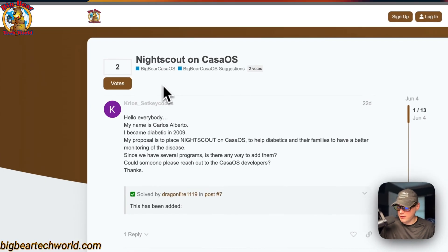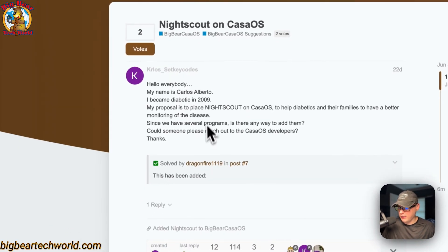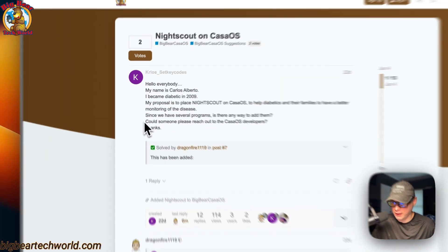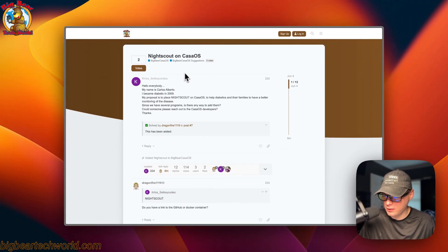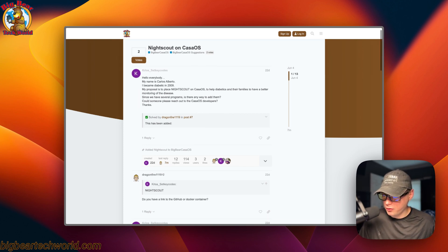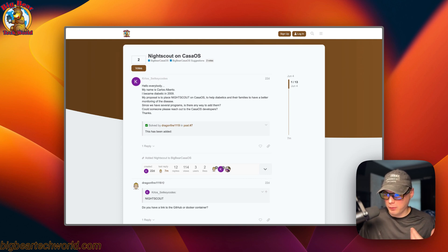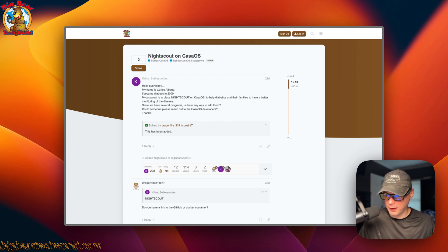I got a request to add Nightscout on CasaOS — the person's name was Carlos Alberto. He's been a diabetic since 2009 and wanted this added, so I tried to get it done as soon as possible. I did it for CasaOS first, but I wanted to bring it to more platforms to help more people. I can't test it fully because I don't have sensors, but I tested it up to the UI and it seems to be working. If something isn't working for you, go on the Big Bear Community, start a post, and let me know the error or any logs so I can get it fixed.